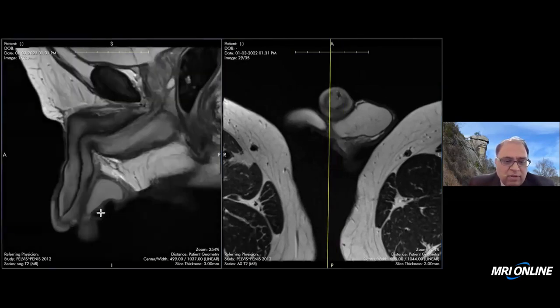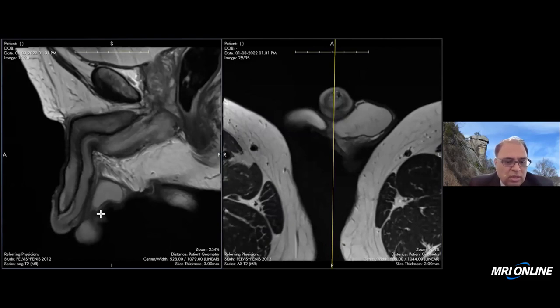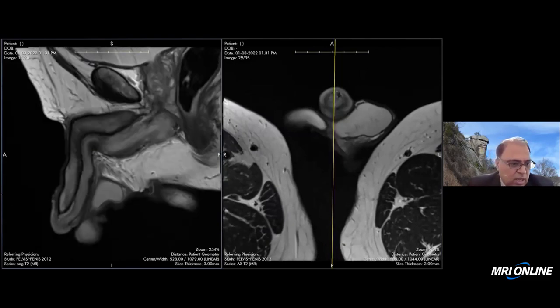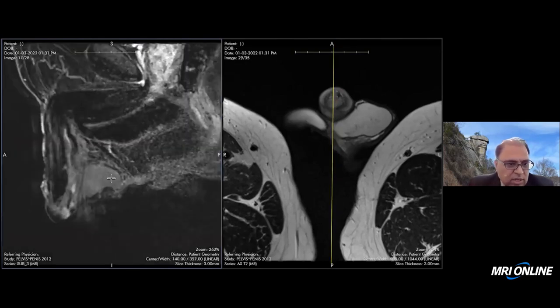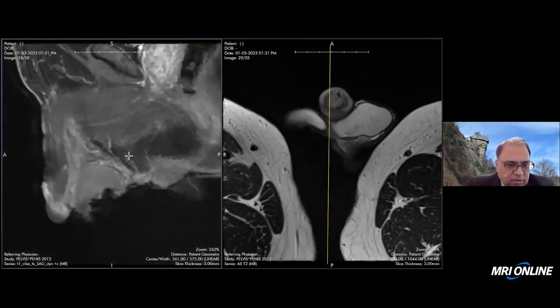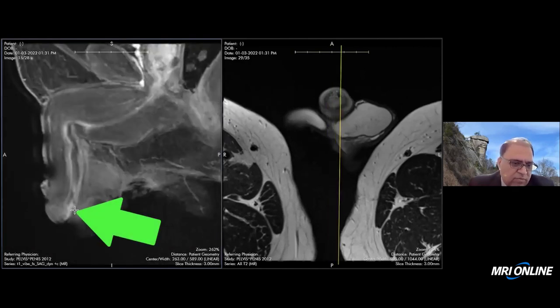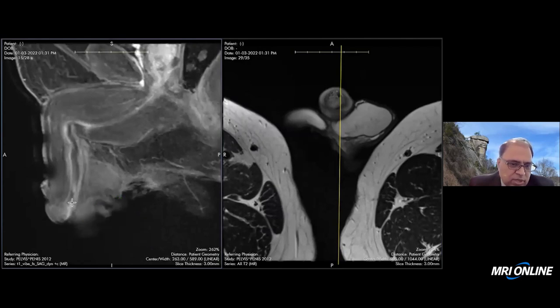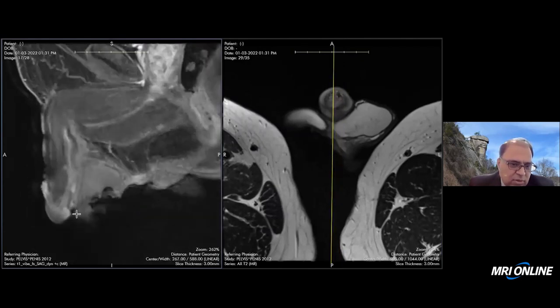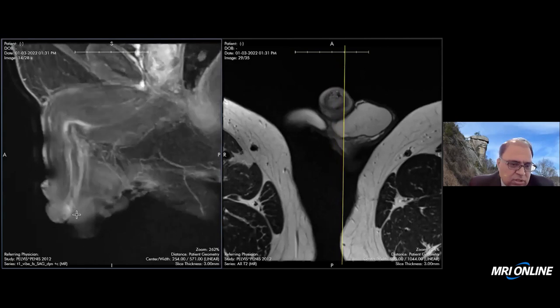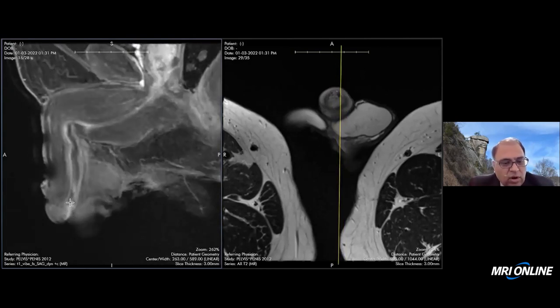Showing a negative case is also good because that gives the surgeon confidence that it is not infiltrated too much. We can quickly go to the post-contrast images and see if something different is there. We are seeing a little bit more enhancement than expected, which corresponds to the known cancer in that location, but we do not see a hypointense mass or a clear outline of the mass.